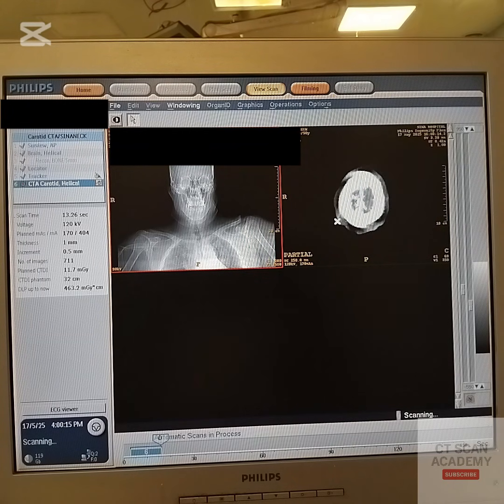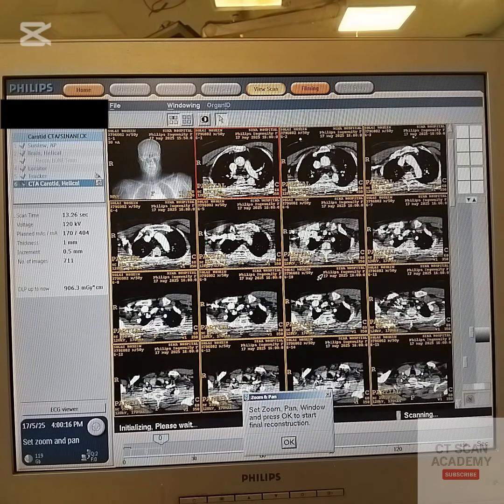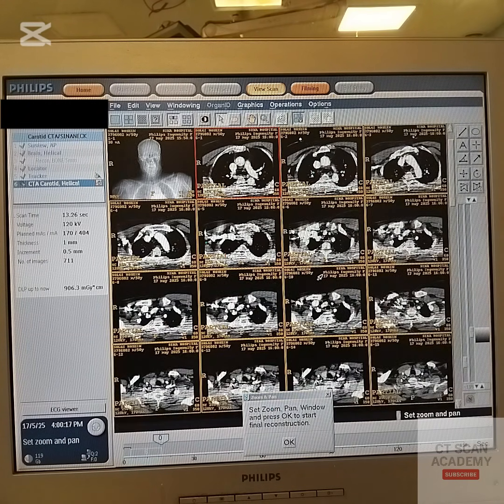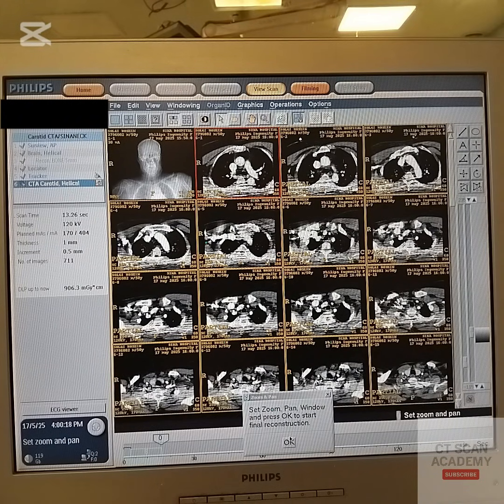After scanning, preview images appear. Adjust the field of view and image contrast if needed, then confirm to generate axial reconstructions.